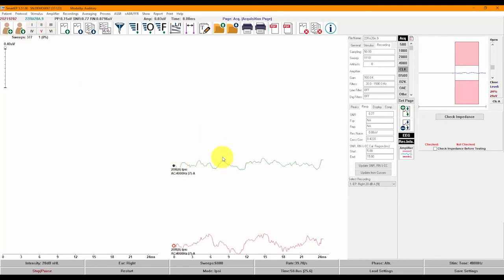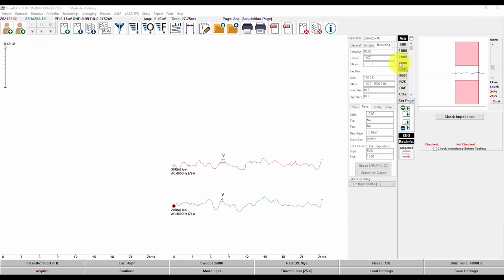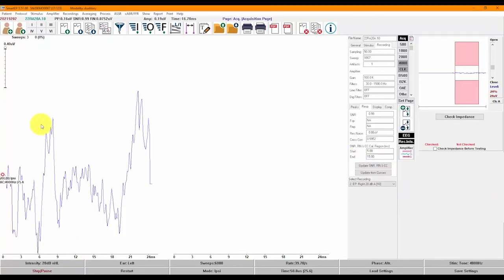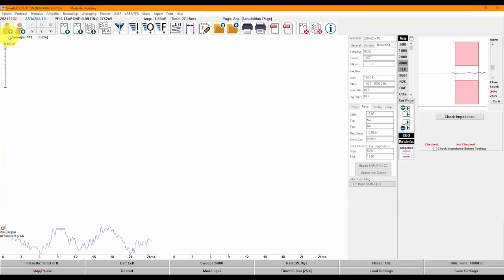When you have a recording selected and it is green, as you move along the recording you will see your position in time displayed at the top of the screen. I will label the peaks as before. While the recording is in progress, you can adjust the placement of any peaks at any time by clicking on the label — it will become red — and then moving the latency and amplitude markers as needed. I will send the data from the right ear to the 4000 Hz page and continue with the left ear.